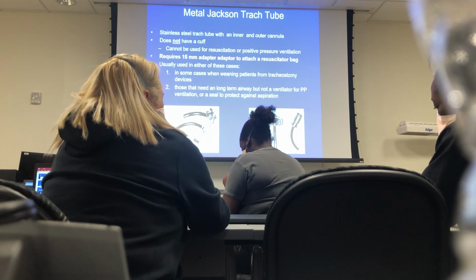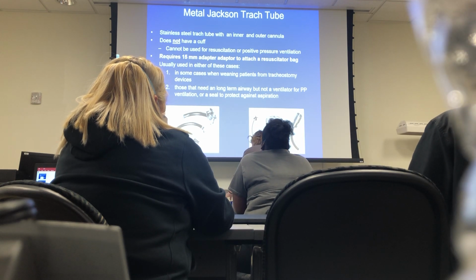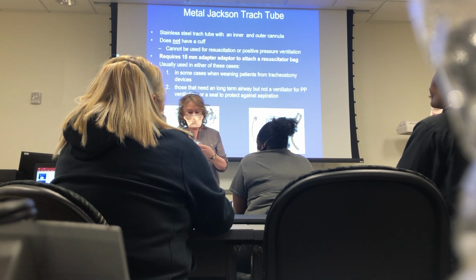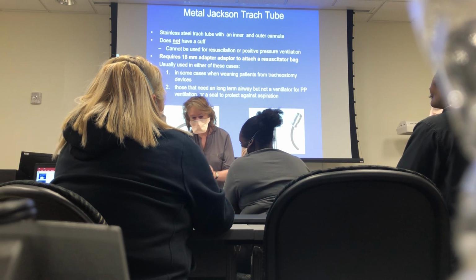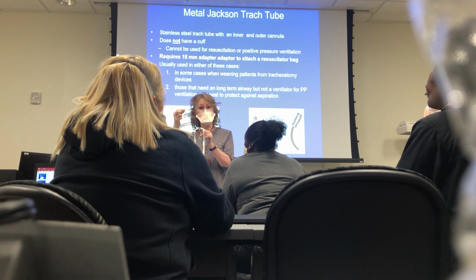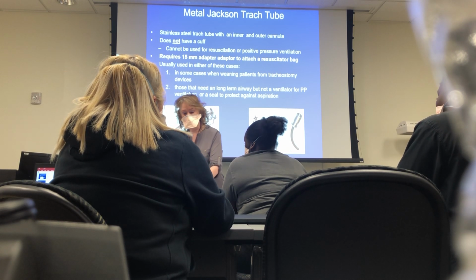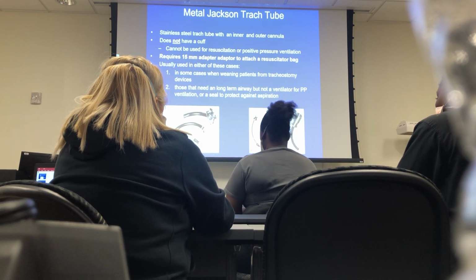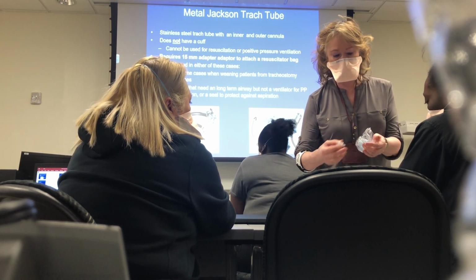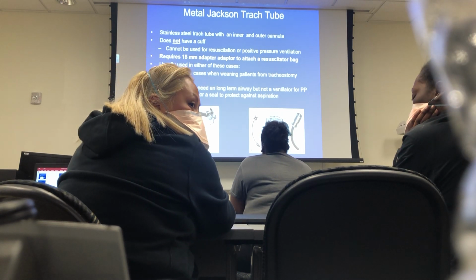Got it? Okay, now, how would you bag somebody with those? You can't do it. So what you have to do is find a little adapter, and usually they have specific adapters in hospitals that are sized, but if you're really hard up for an adapter, pull one off the end of an ET tube that will fit down there, so you can at least give the patient 100% oxygen. This is not gonna be a perfect fit, because this is a wide one, okay? But that's how you would do it, and you would attach those to the bag, because you couldn't attach a bag on there.